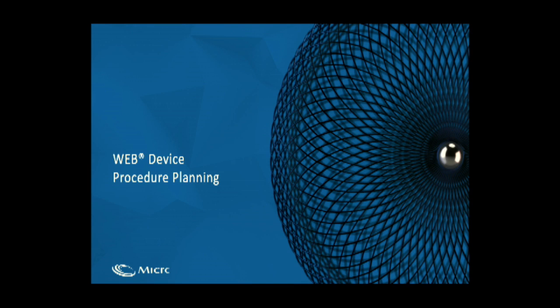It is a possible web case. We thought it's a good idea to go over the procedure planning a little bit, so I jump right into the procedure planning. I leave out the device introduction. Maybe I have a chance to tell you about that later too. So let's dive directly into procedure planning and get through the most important steps.